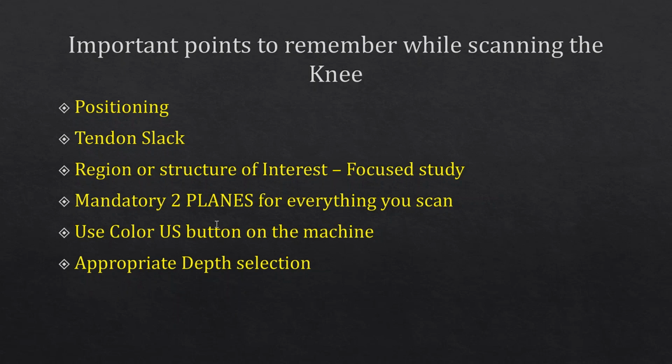Although it's not very common to have peroneal neuropathy at the fibular head unless patient was bedridden and there is sudden loss of weight. It's not a common entrapment to have. But what you would do is you'll scan the peroneal nerve at the level of fibular head, and also going a little bit more proximal around the knee joint, because most of the time if prolonged bed rest or sudden weight drop is not the reason, the second common reason is there's a space occupying lesion. So you will see a mass, maybe a ganglion cyst arising from the joint, or a soft tissue mass tumor compressing the nerve. That's the kind of presentation you may see if the peroneal nerve is entrapped at the level of lateral knee.